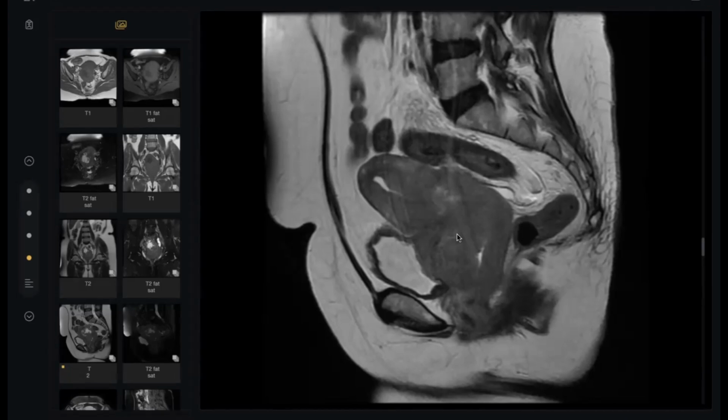And this is very important, my colleague. When you find a cavitating metastasis within the lung, if the patient is female, tell the examiner, doctor, cancer cervix should be excluded. If he is a male, doctor, we should exclude any head and neck squamous cell carcinoma, like tongue cancer, whatever.